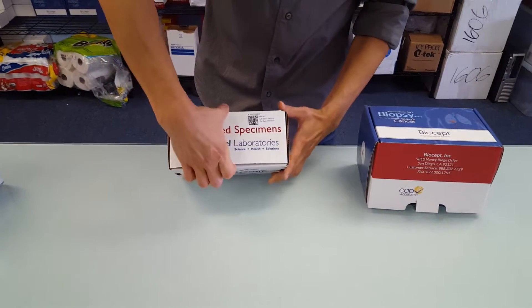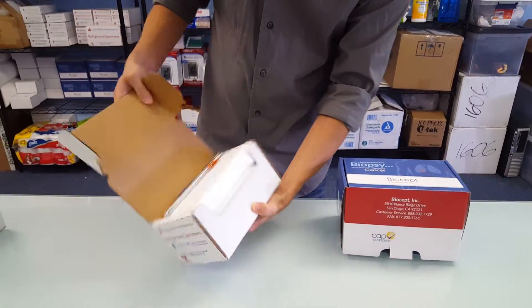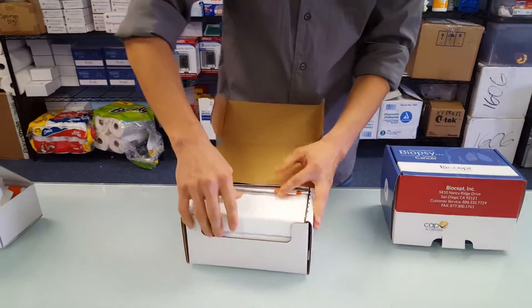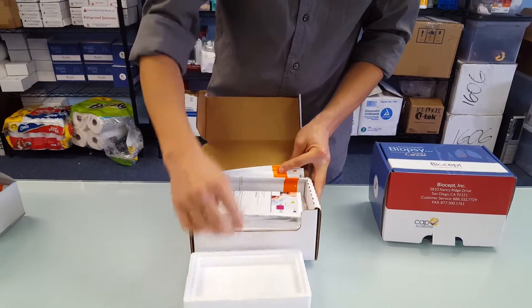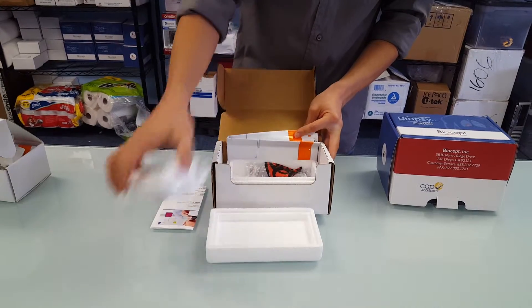Here's another kit. Now this kit does not include the phlebotomy supplies. This kit has a nice styrofoam container. It includes the processing instructions, which is always nice to have. A freezer brick.